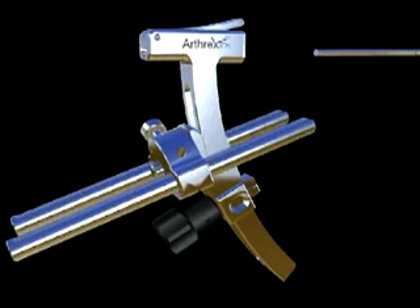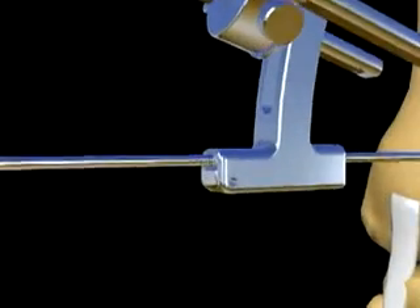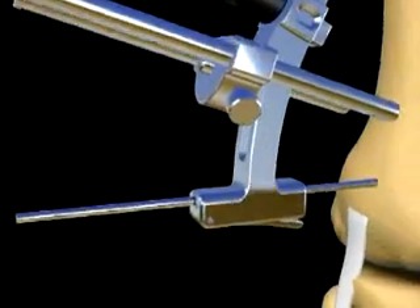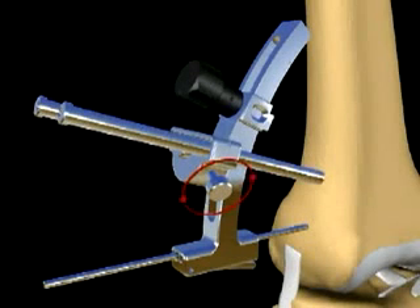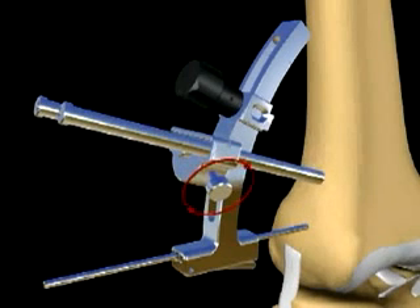At this time, the osteotomy guide is assembled. It is positioned opposite to the tibial technique and secured to the pin until the laser line is flush with the back of the guide. The parallel sleeve assembly is adjusted so that the 2 mm osteotomy cutting pins are positioned superior to the patellofemoral joint.